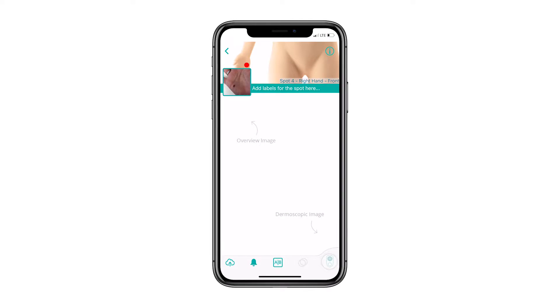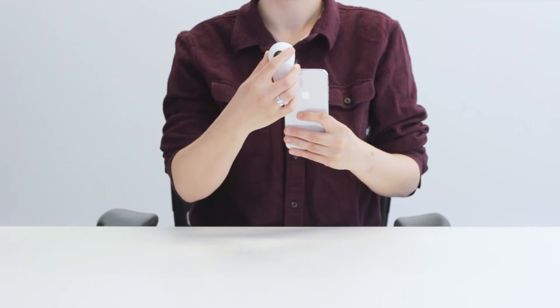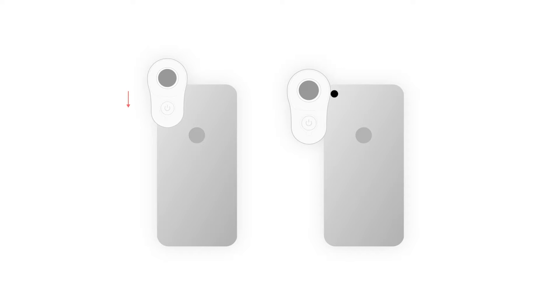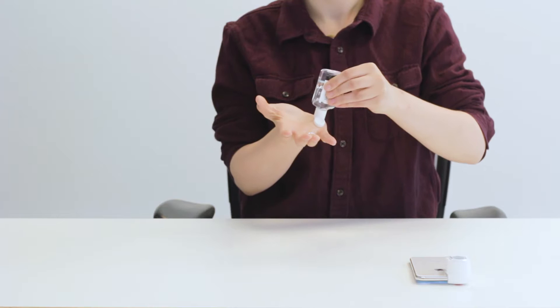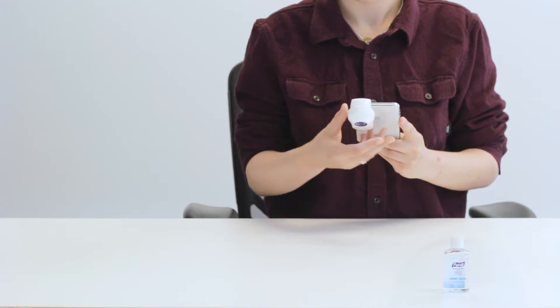Next, let's take a dermoscopic image. Tap the Molescope icon in the bottom right corner. Gently attach the Molescope device to your phone — there is no need to use heavy pressure. Slide the device until it fully covers your phone's camera and turn on the light. Depending on your phone, the Molescope will either slide down or to the right to fit to the camera. Though optional, we recommend applying a drop of fluid such as rubbing alcohol, disinfectant gel, or oil to your lesion as you image.